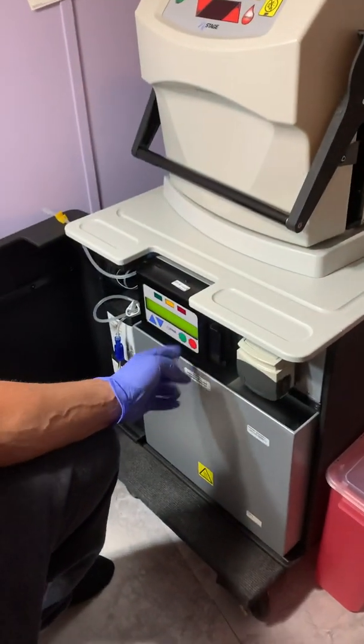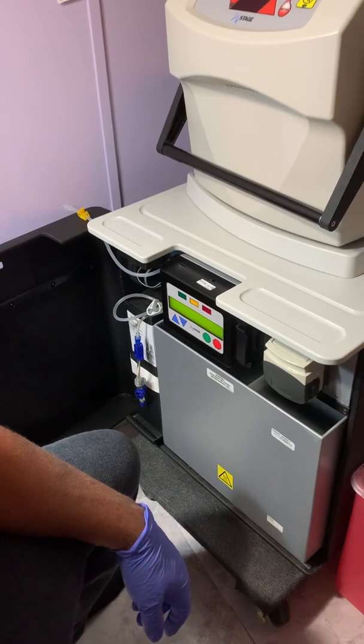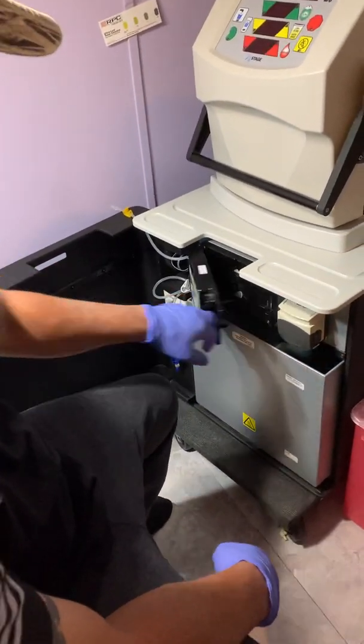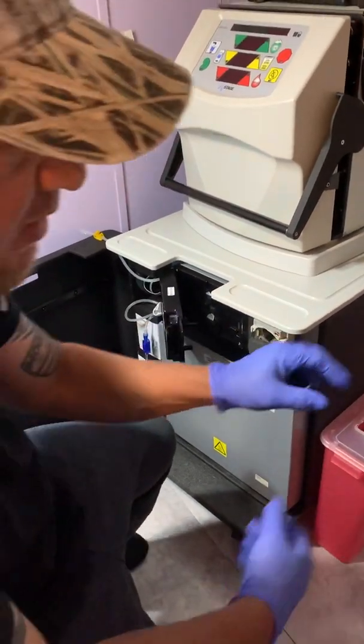We get our sack. Let's start by pushing go — that's what it tells you to do. It says open door and load sack. You open this door, open this little flap right there.